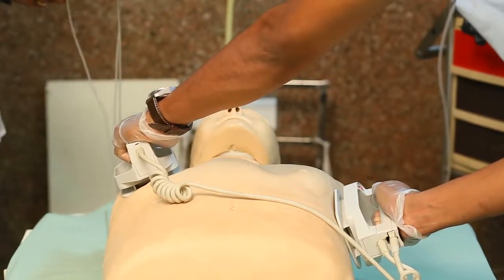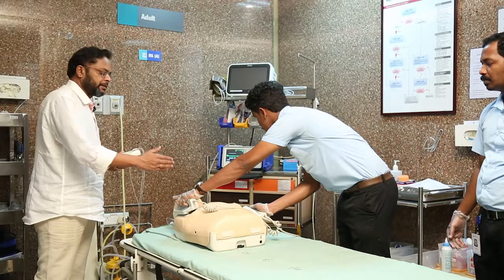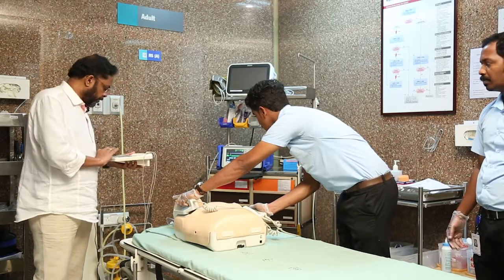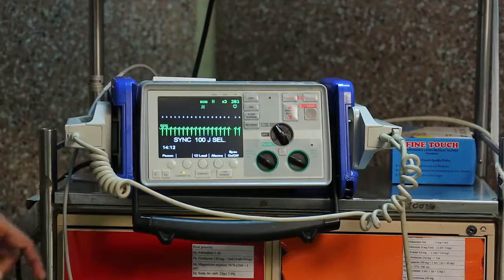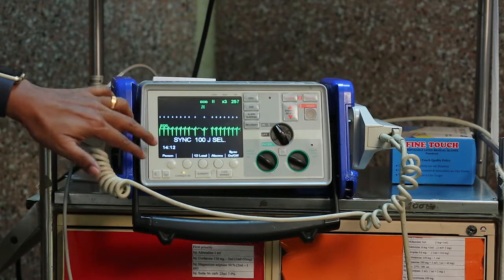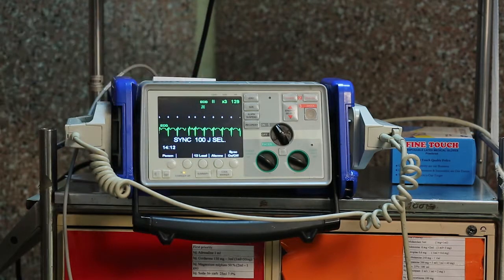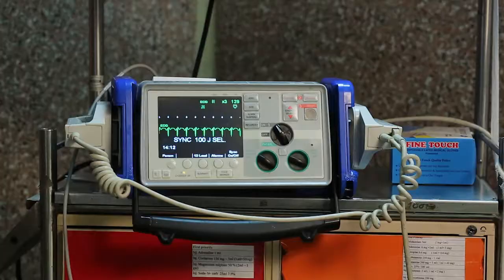Simultaneously press both buttons and hold them down for some time to ensure the shock is delivered — unlike defibrillation, you must wait until the shock is actually delivered. The shock has been delivered, and we can see the rhythm has now converted to normal. Cardioversion is effective.